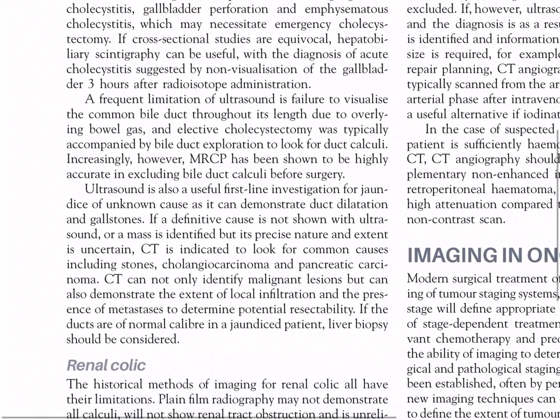A frequent limitation of ultrasound is failure to visualize the common bile duct through its length due to overlying bowel gas, and elective cholecystectomy was typically accompanied by bile duct exploration to look for duct calculi. Increasingly, however, MRCP has been shown to be highly accurate in excluding bile duct calculi before surgery.